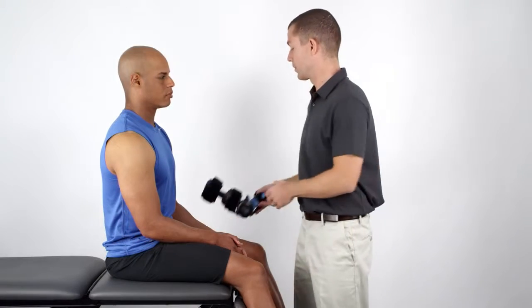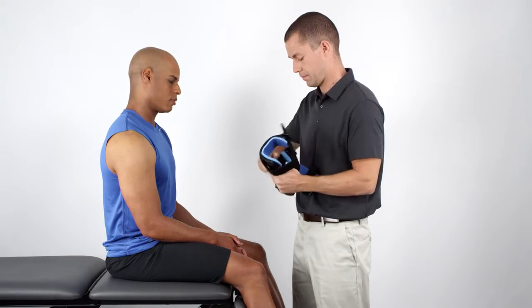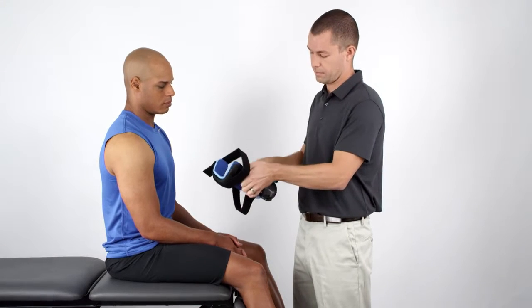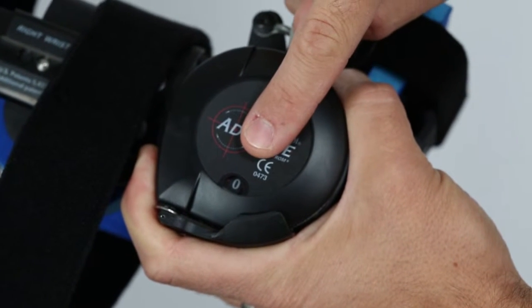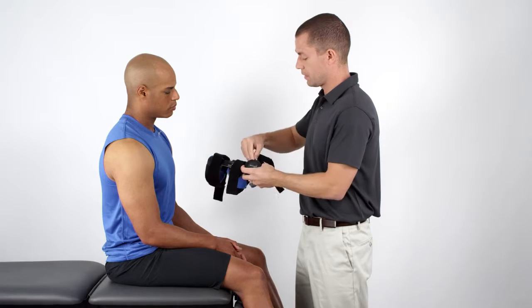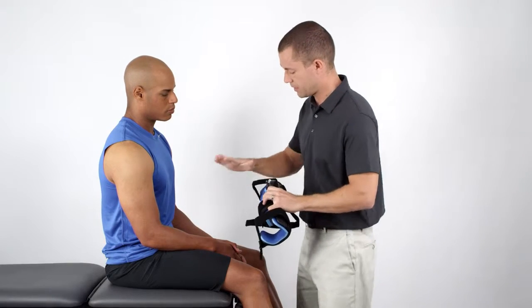At the initial fitting, unfasten or loosen the adjustment straps on the cuffs. Then check the tension control indicator and make sure it is set at zero. Next, lock the device in a neutral or resting position close to the patient's current wrist angle.